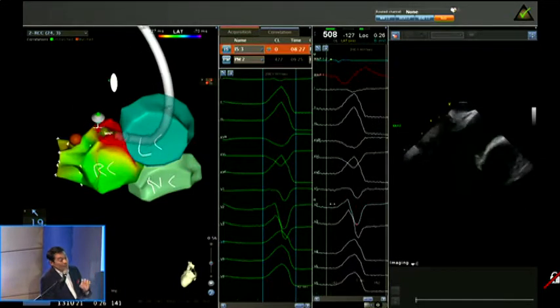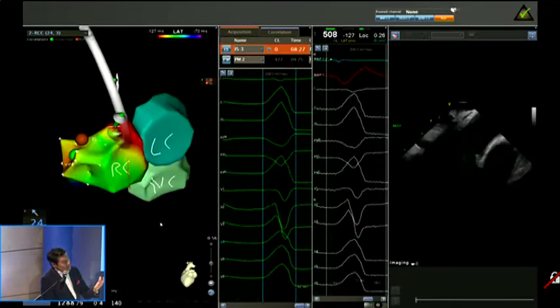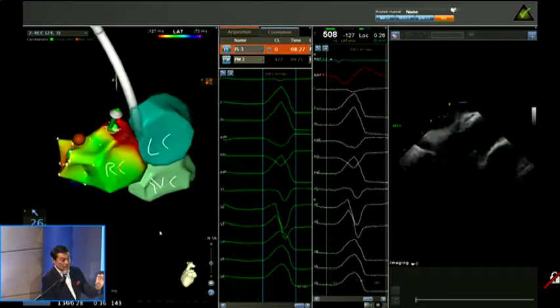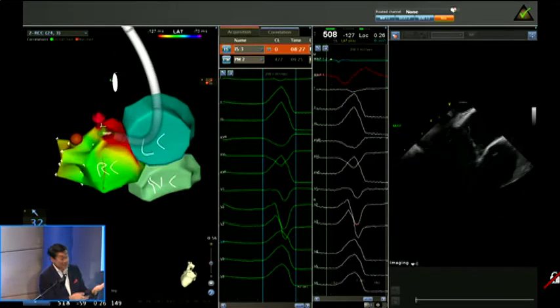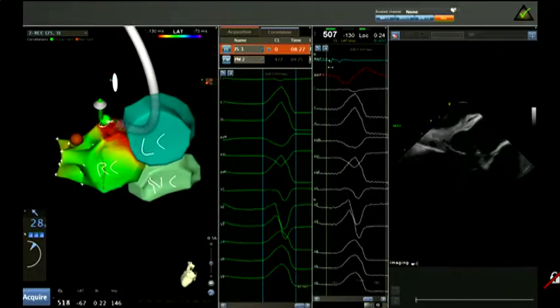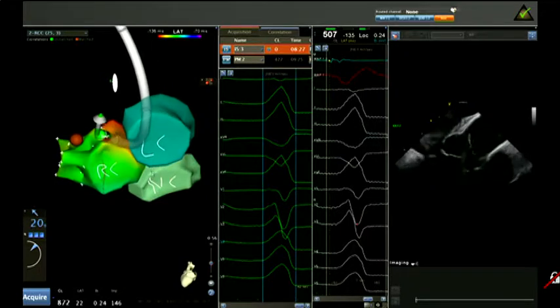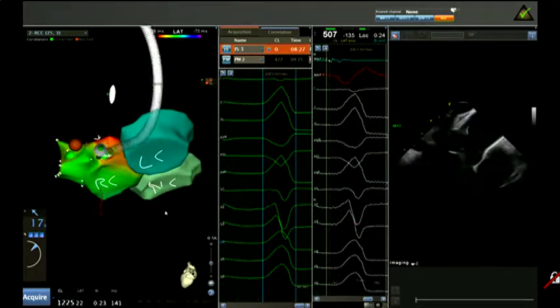It depends also on the technology, yes. So the truth is that with whatever technology you use, you need to save time. And if you're going to be doing something on the septal side, do something restricted. That is the key of doing the differential diagnosis, of having 2 or 3 differential diagnoses. Why? Because the obsession that we used to have, we started to map everything, the right ventricle, etc., and it would take a lot of time. What you simply need to do is, based on your deductive analysis, take some restricted points of this area and go to the other side, but bearing in mind the limitation that we're going to have because of the very scarce number of extrasystoles in this patient.